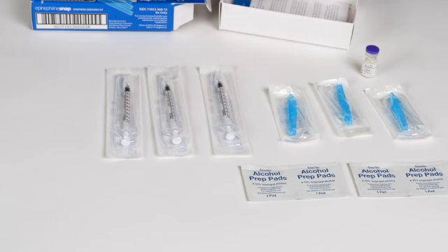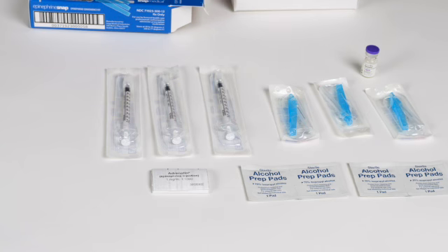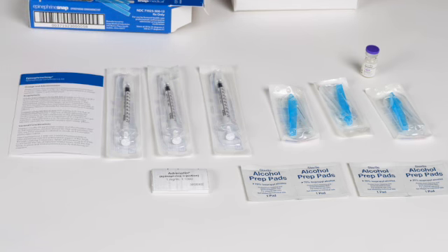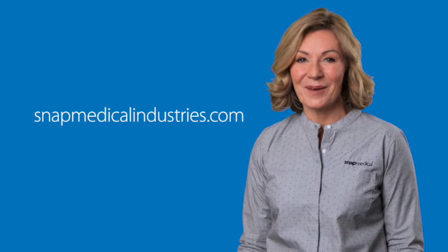1 manufacturer's package insert for epinephrine, and 1 epinephrine snap instructions for use card. Learn more about our products at snapmedicalindustries.com.